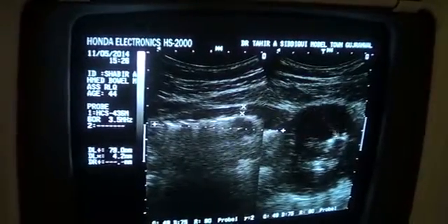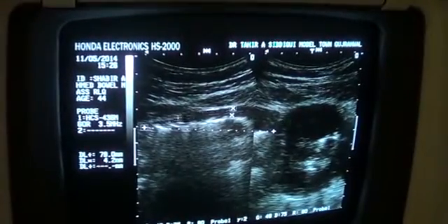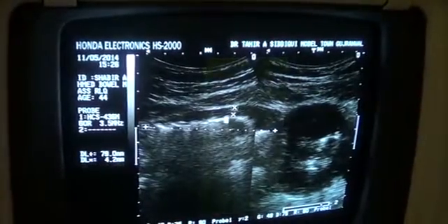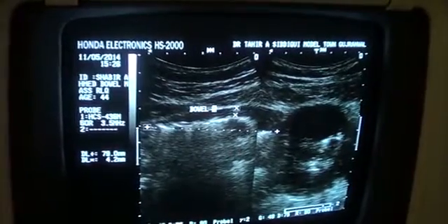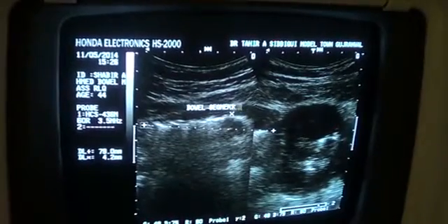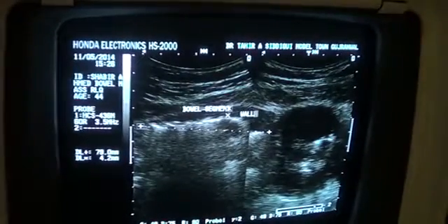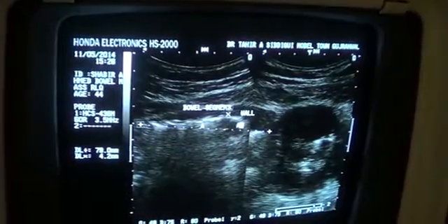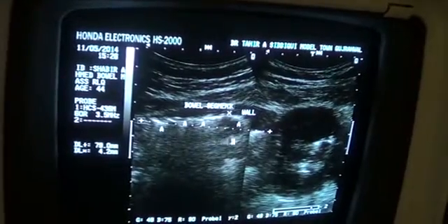This is a bowel mass, ileocecal mass, but here it is just a linear, tube-like structure with trapped air. Now this is also a bowel segment, and this is the wall of this bowel segment. This is the trapped air. No peristaltic movement is seen within this segment of the bowel.